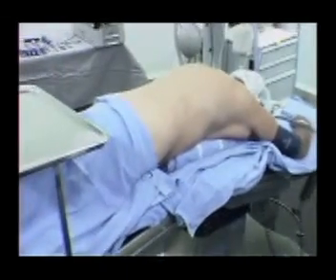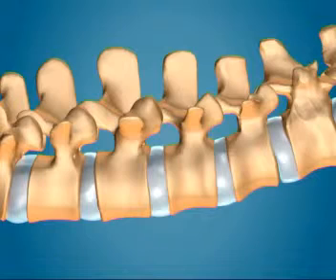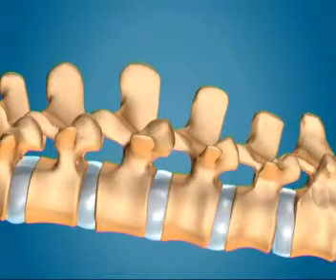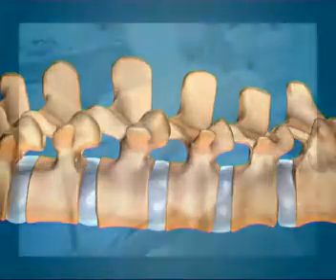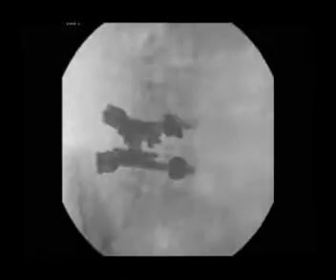Preoperative planning. The patient positioning is critical. An overly kyphotic position will lead to higher loads on the pedicle screws, while an overly lordotic position may limit the flexion motion. Therefore, you should position the patient in a neutral lordotic position, avoiding hyperlordosis or kyphosis. It is mandatory that there is ample access for the C-arm X-ray equipment.